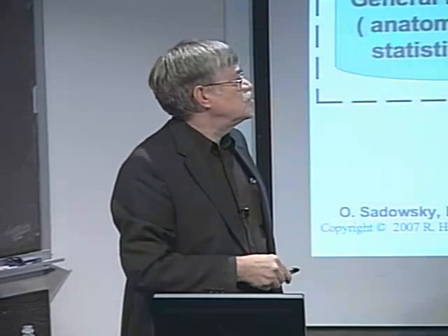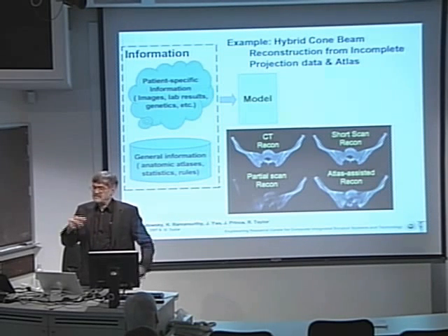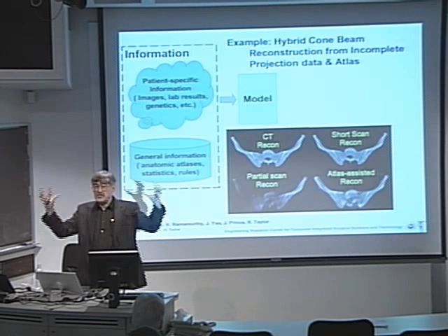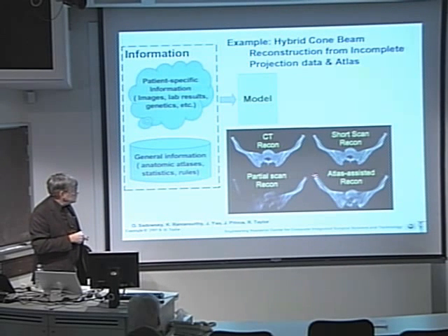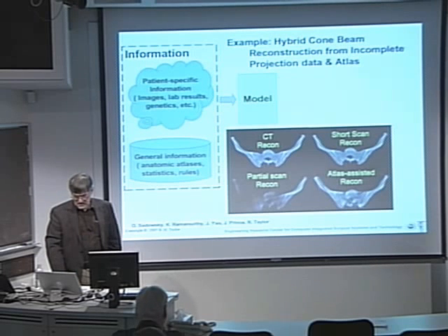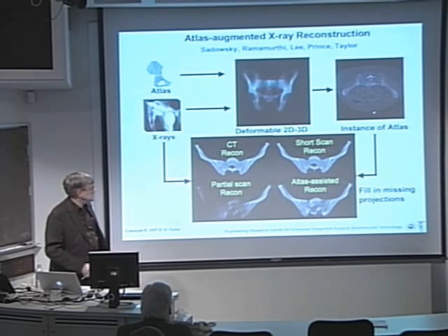So the idea that we've been evaluating has been to do a deformable registration of our model to the X-ray images that we have, then use the fused representation or the model to fill in any missing projections, and then go back and do tomographic reconstruction. And as you can tell, we're able to remove quite a lot of the artifact. Again, this is a fairly old image from Krishna's thesis. We've just now got all of this working on a real fluoro system, and I just didn't have time to get the image in there. But again, here is the process that we're doing.